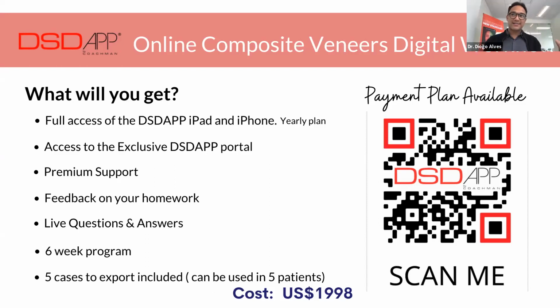You get the full access of the DSD app. So just so you understand, you're not paying just for the course itself, which already brings lots of value. After you finish your course, you still get all these benefits throughout the year, so you can continue with this digital workflow. And as you could see, it's very powerful. And for the cost itself, you get 1 patient, you already cover it. Exactly, I was just about to say that you get 1 patient, it's paid for. And for those of you interested and that do have an iPhone, it's really easy.